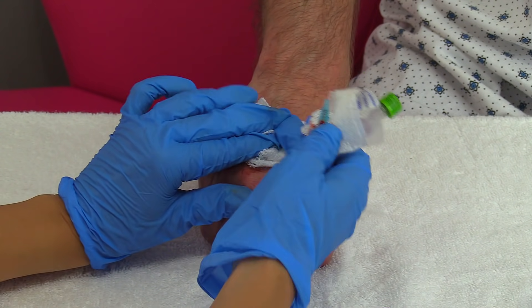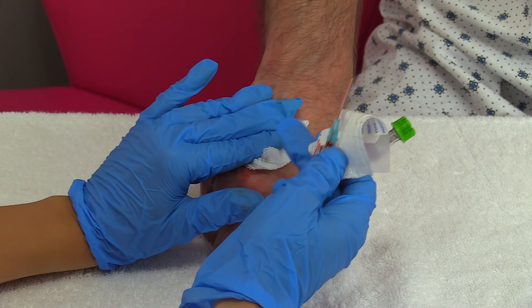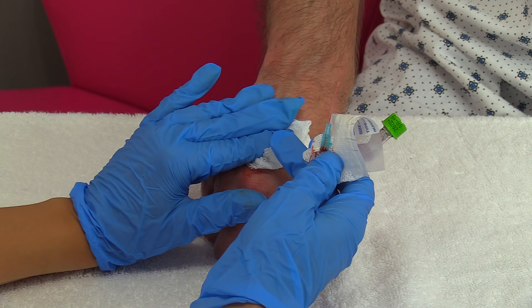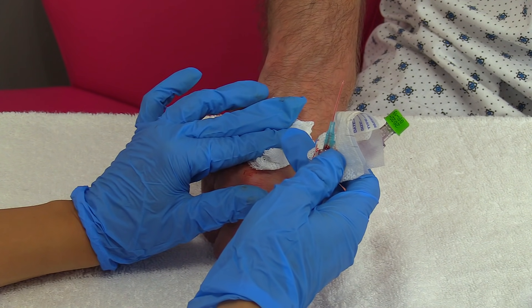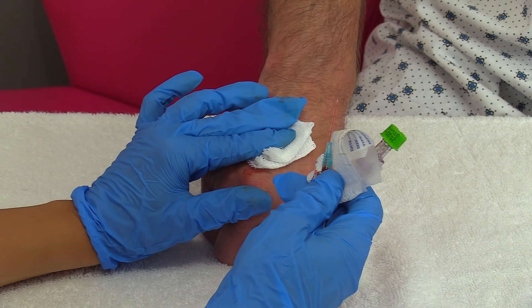Hold firm pressure for about two to three minutes — you really want to hold pressure because you don't want blood to seep under the skin and cause a bruise. This is especially true for patients who are on anticoagulants; you will probably have to hold even longer and just make sure it's firm pressure.